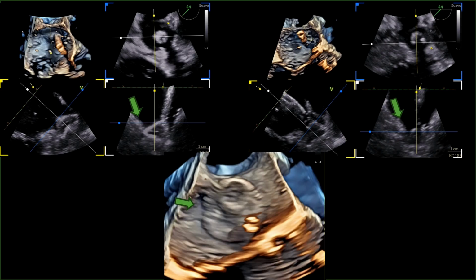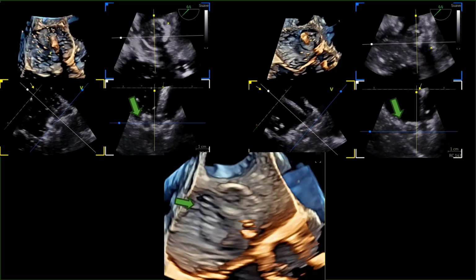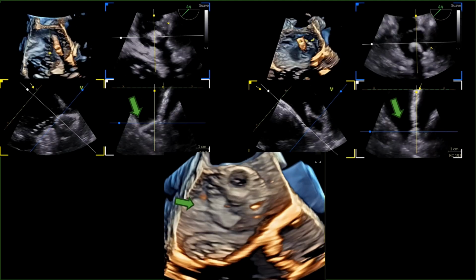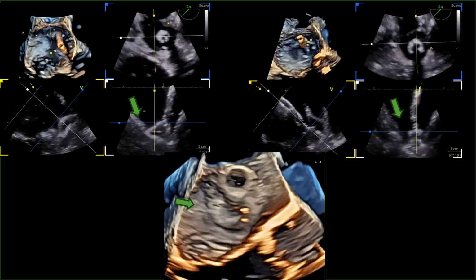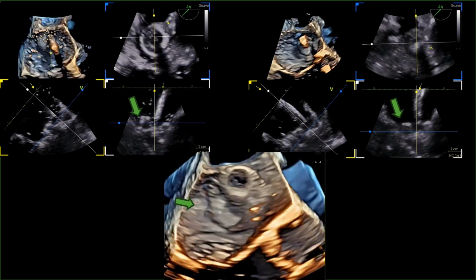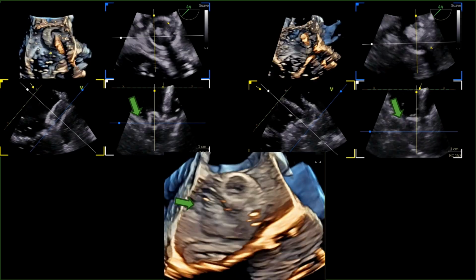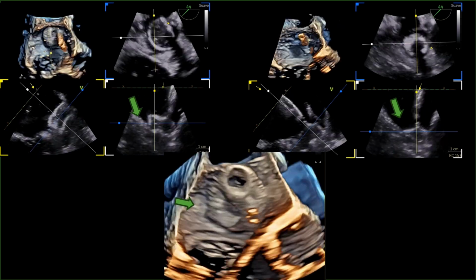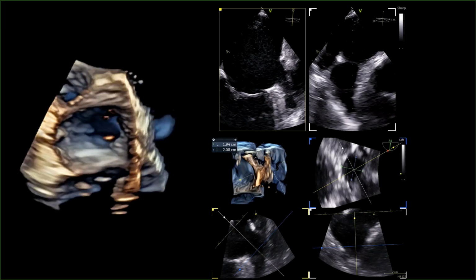And just talking with Jordi, the engineer, it is exactly this area, the area that now he's studying in patients with previous closure, that he's starting to see some problems in, because to cover the pulmonary ridge in the 60 degrees, it's easy, but to look at the 135, if you do it directly or with your eyes, it's very difficult. And also, it's not only this area of the 135.